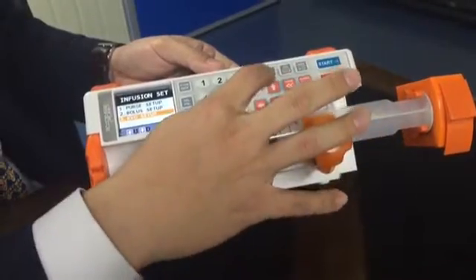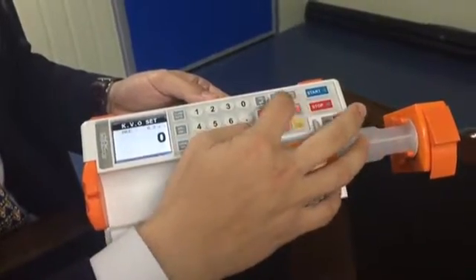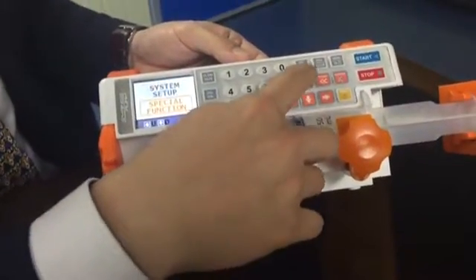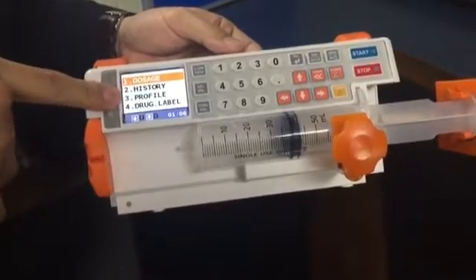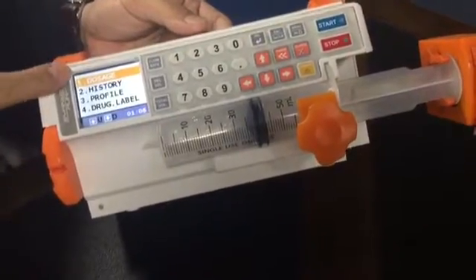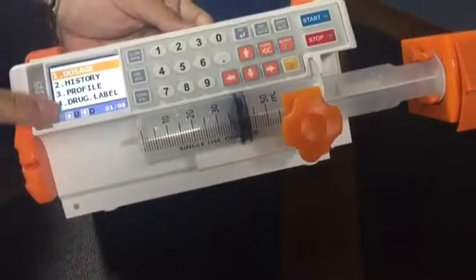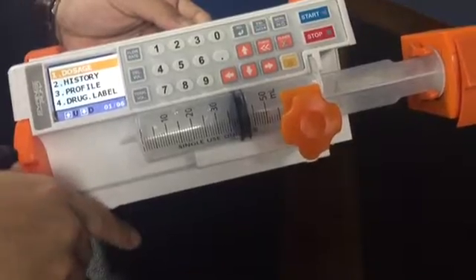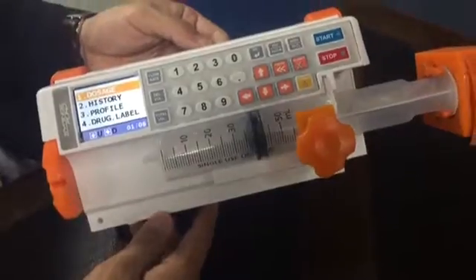In the special function, there is dosage, history, profile, drug label, and more. All of these are optional, so if you want to use these options, you can ask the manufacturer or agency. That's how to use and control this machine — it's easy to use and simple. Thank you.